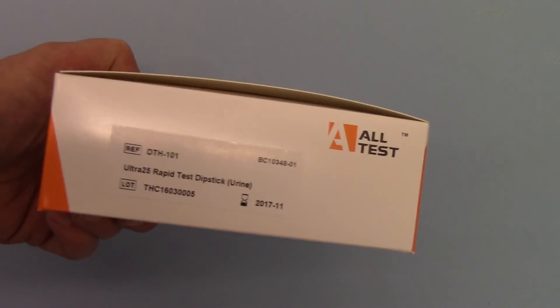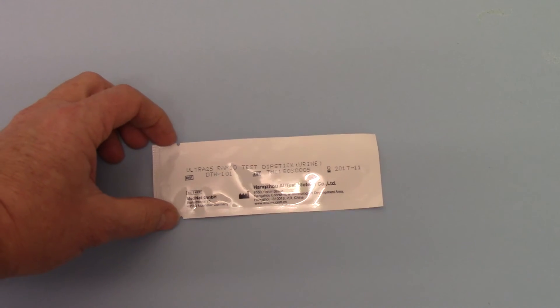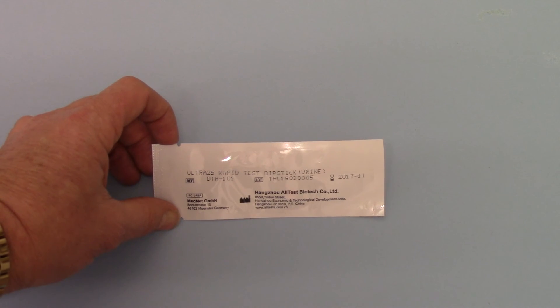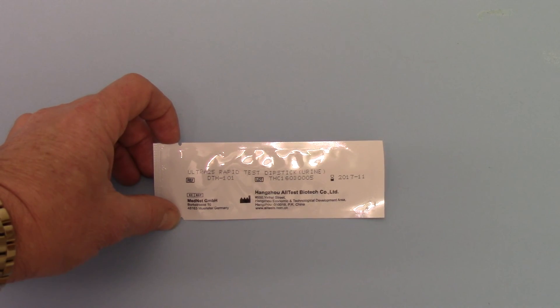This carton contains 50 and these are for sale on the UK Drug Testing website. The actual packaging on the foils is a standard Alltest foil, labeled Ultra 25 rapid test device urine, catalogue reference DTH 101, with a lot and expiry date.